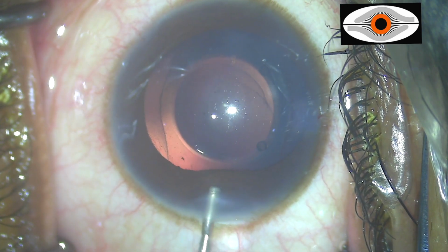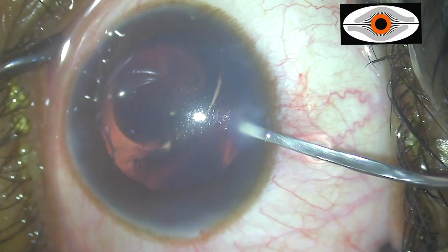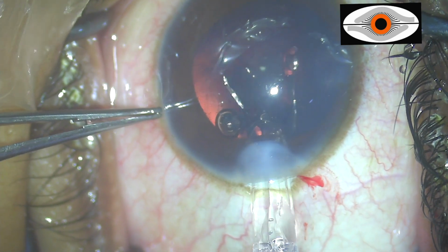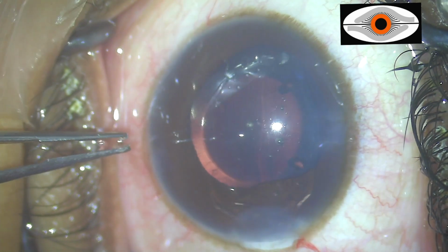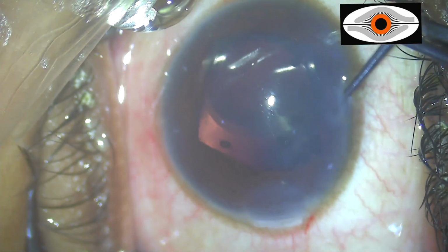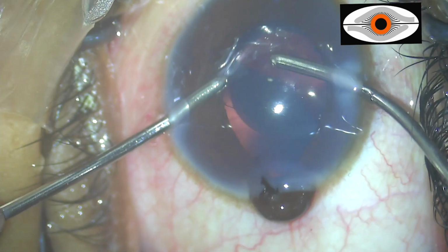For the other eye, the basic surgical technique remains more or less similar to that of the first eye. Another challenge which can occur sometimes is floppiness of the iris with iris prolapse because of repeated manipulations.